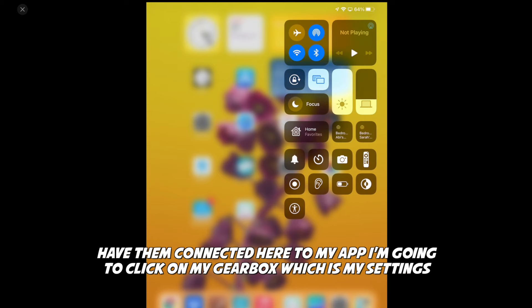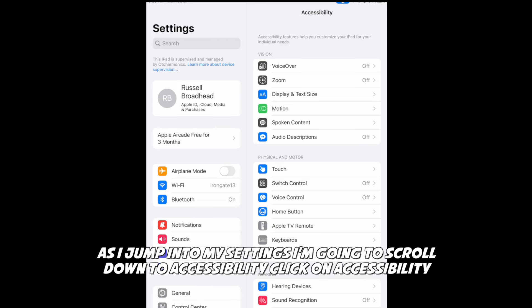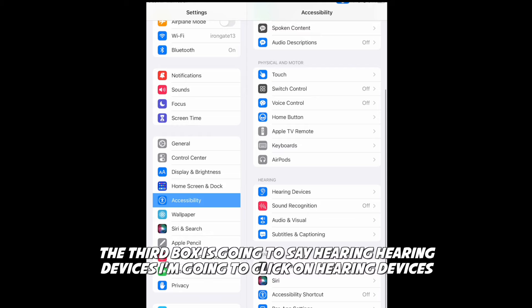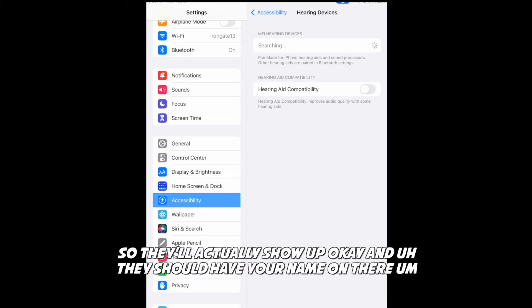So now I'm going to show you. I'm going to click on my gearbox, which is my settings. As I jump into settings, I'm going to scroll down to Accessibility and click on Accessibility. The third box is going to say Hearing — Hearing Devices. I'm going to click on Hearing Devices. Now it's actually searching for the hearing devices, so I'm going to take them off the charger so they'll actually show up.